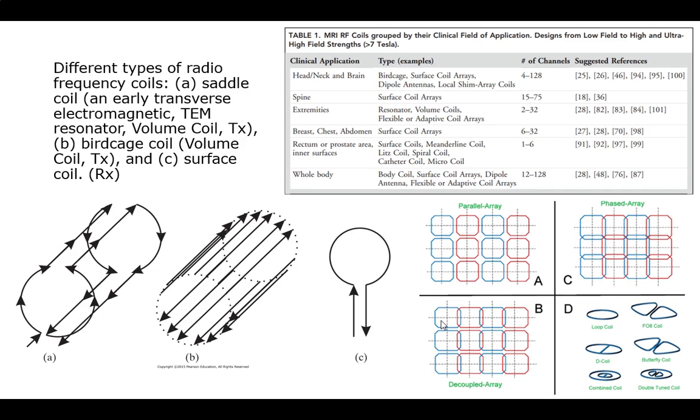Your body will have noise in itself, right? But that's all going to be related to Brownian motion. Those kinds of random fluctuations within your molecules are going to cause some noise kickback. But this induction here is another whole level.